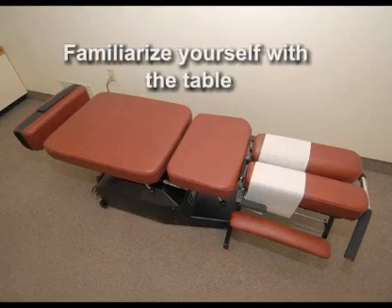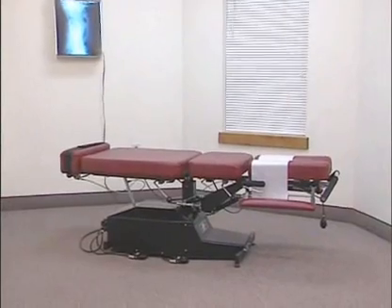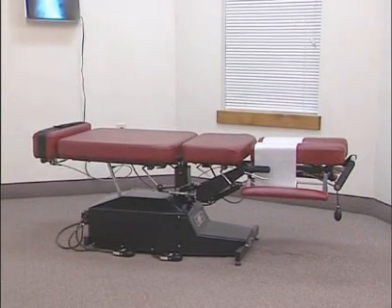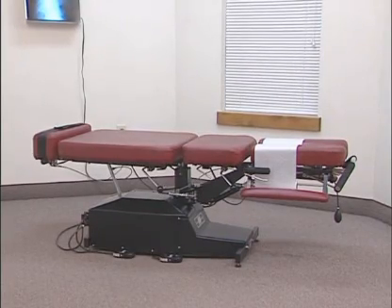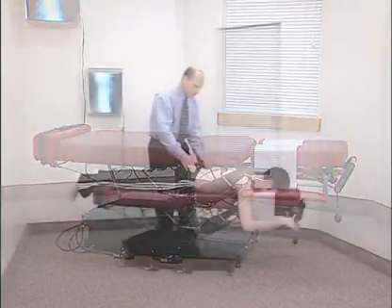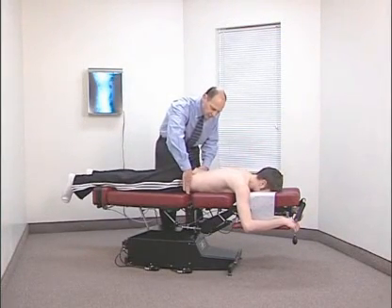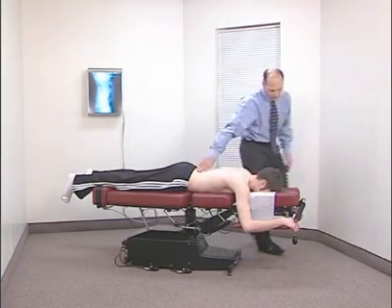Proper patient-to-table positioning is very important. Allow time to familiarize yourself with the table and all the movable parts. Always start with the table in a neutral or flat position, with the handlebars positioned next to the face cushion. The ankle support cushion should be positioned next to the pelvic cushion. Position the patient so that the top of the iliac crests are even with the top edge of the pelvic cushion. Instruct the patient to grasp the handlebars.